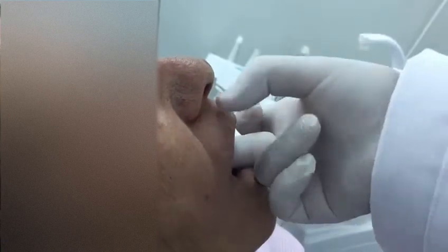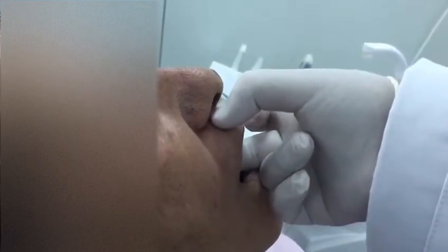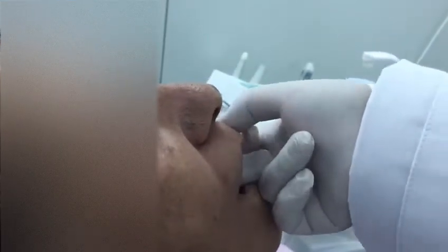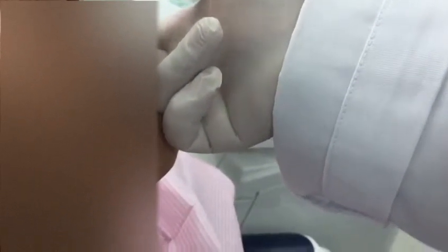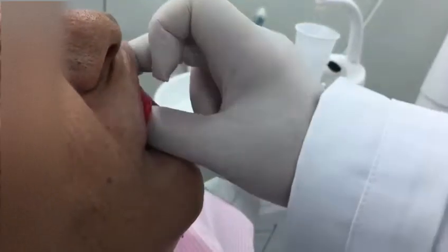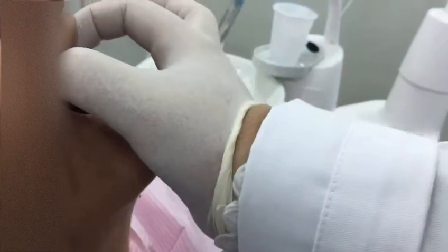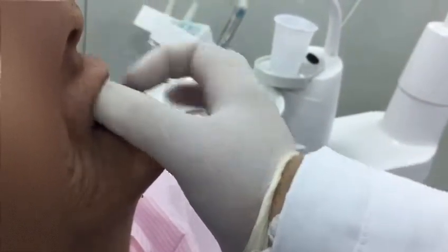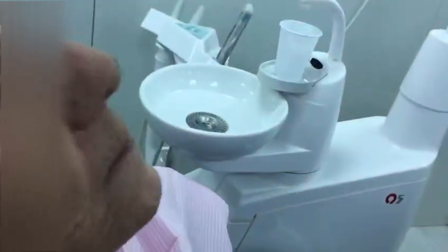Watch the angle just beneath the nose — there is a bulge between the nose and the lip at this angle. All of this responsibility is from that. So you have to trim the base plates. In some cases, patients have a lot of undercuts; the technician blocked these undercuts while working, which is why the base plate is bulging.